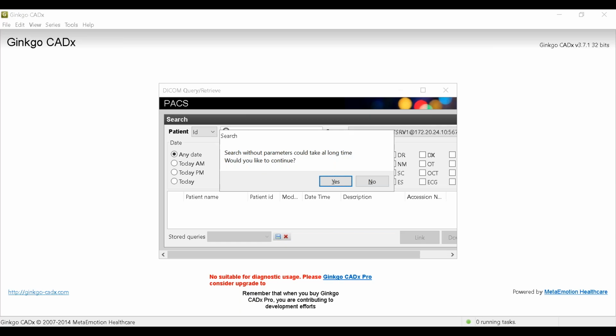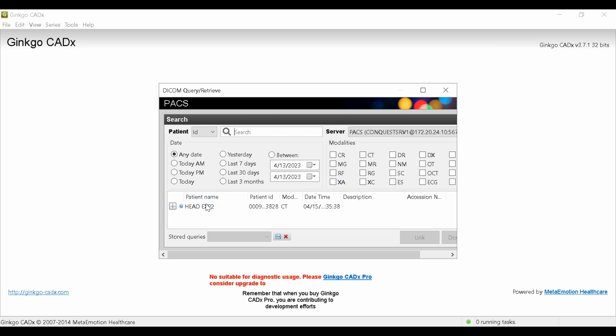It's going to give me a warning and go, you realize these archives are freaking large, and if you ask for everything in it, it's going to be a while. We know we got two things in our archive. Just go ahead and click yes. Notice here it gave me some information. It says patient head X2. Notice this is not on the server software. This is on the client software. This could be on a different machine. All we had to do is change the IP, but have that machine with that IP on the network able to see this one.